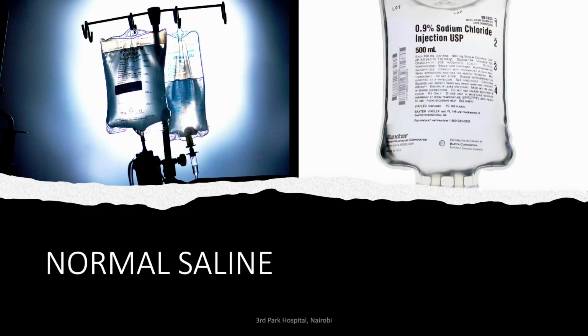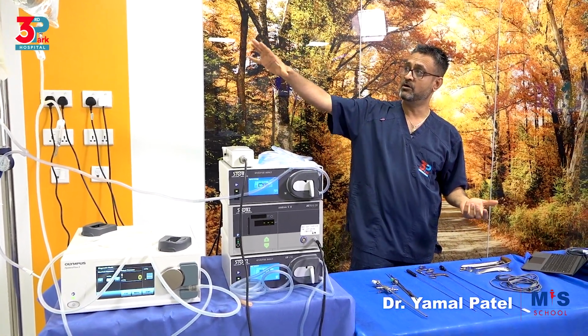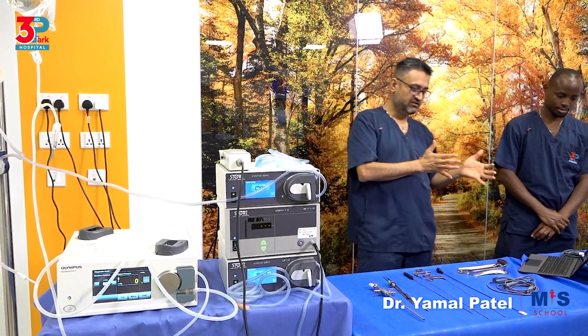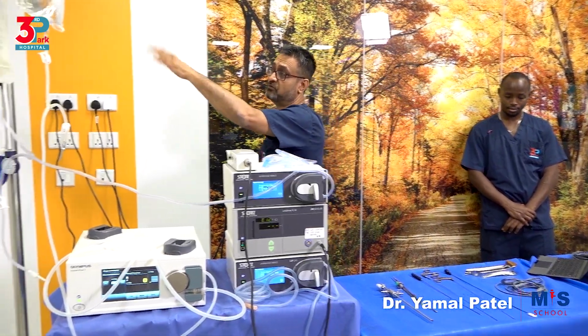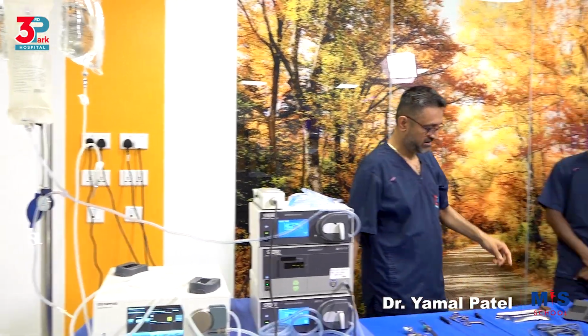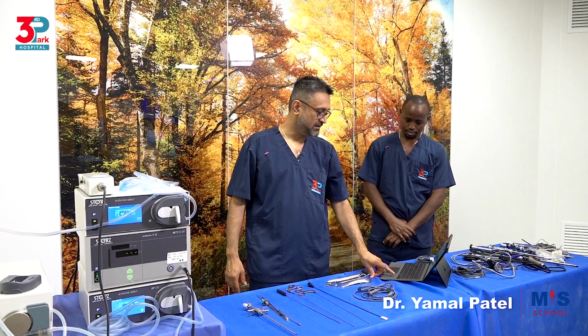You'll be discussing the distending fluids that are available and can be used. At the moment here we have normal saline, and I think most of the focus nowadays is on these isotonic normal saline because it is safe and we can avoid complications with the hypotonic or hypertonic solutions that we have been having in the past.